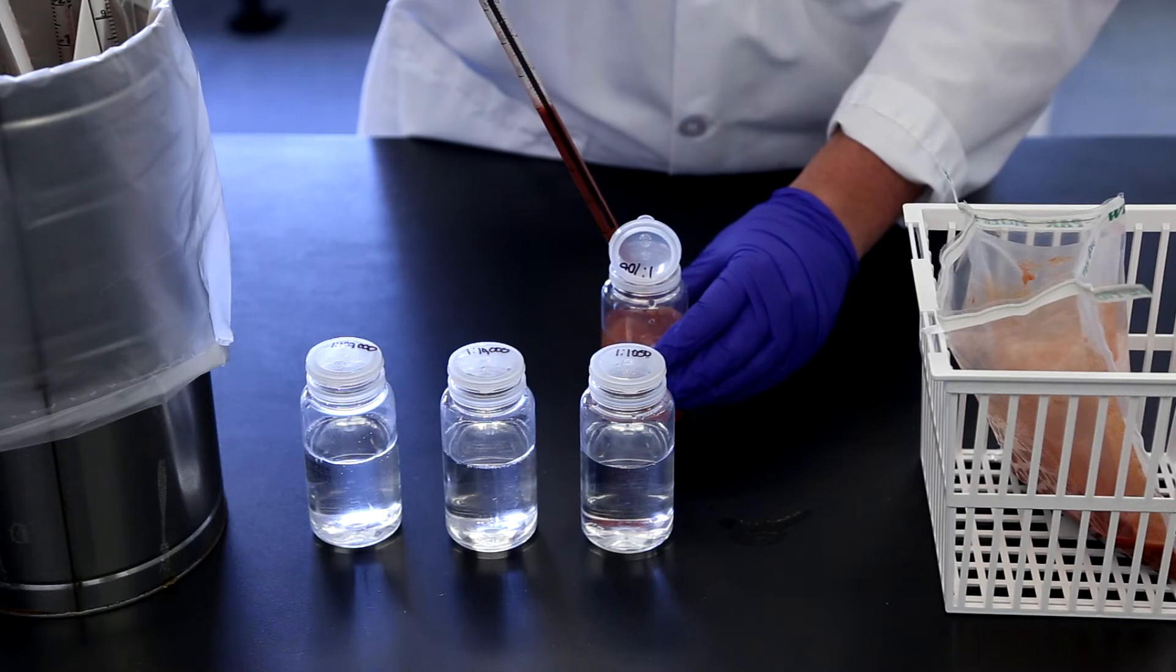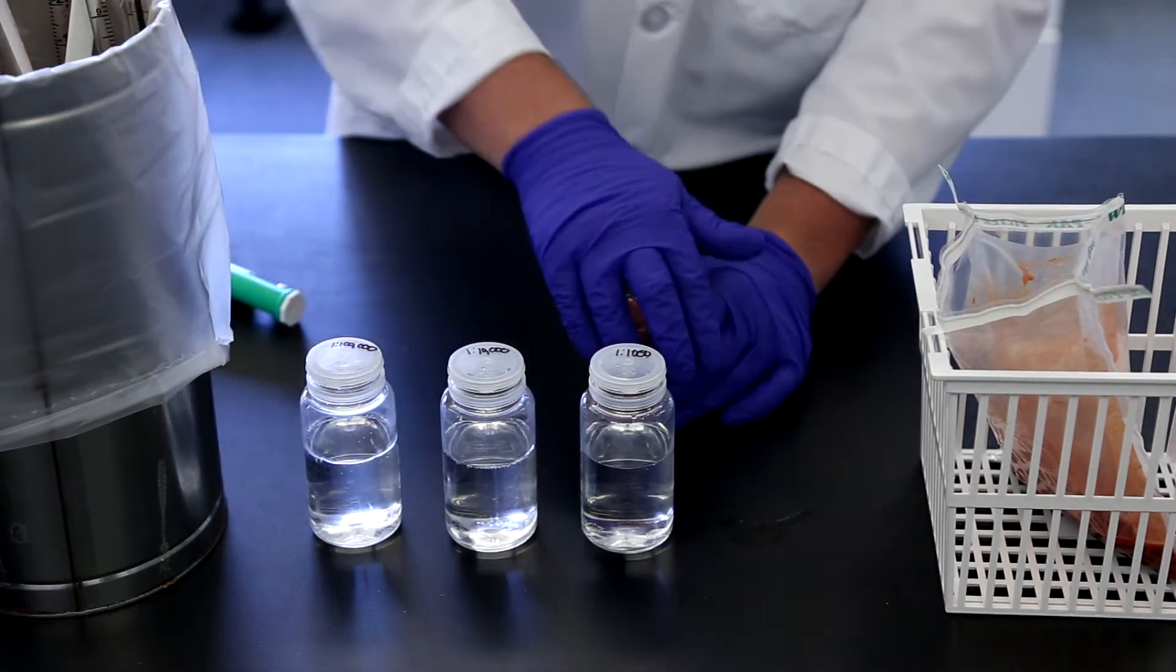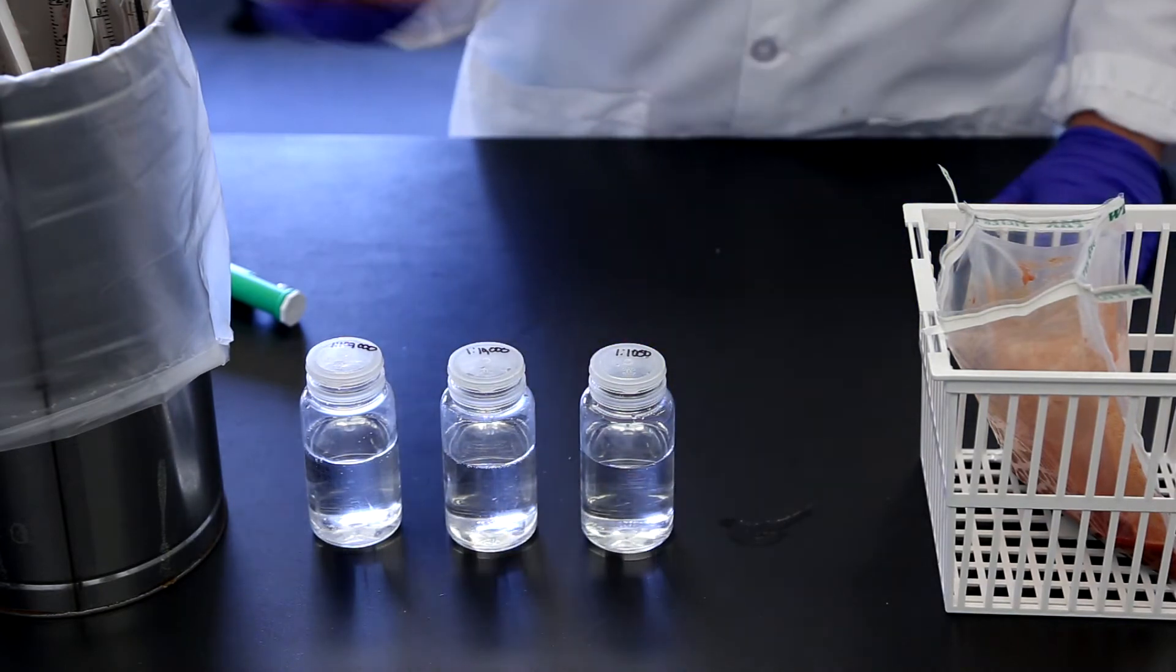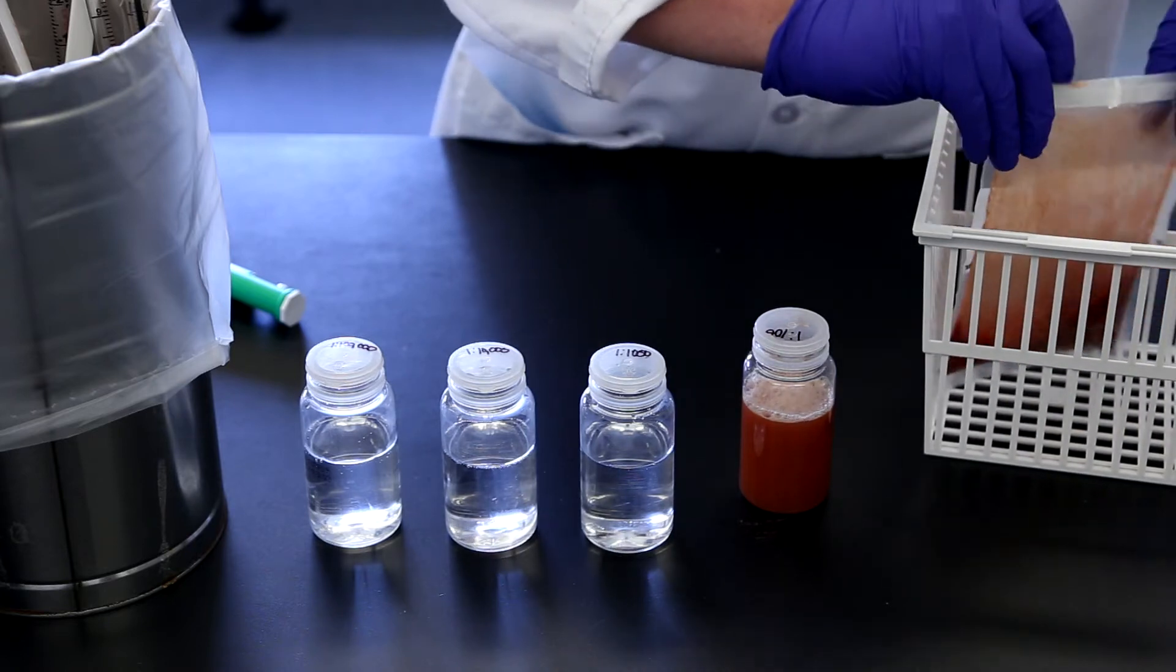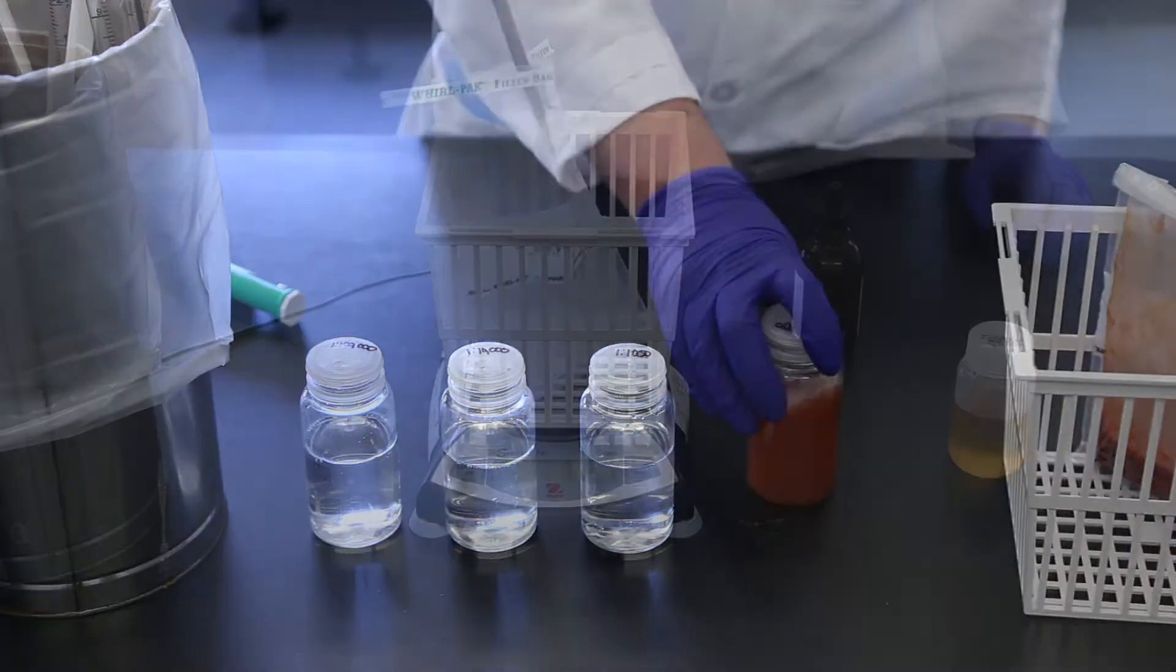Place 11 milliliters of your 1 to 10 sample into 99 milliliters of buffer. Homogenize thoroughly. You now have a 1 to 100 dilution. Repeat this process as necessary up to a dilution of 1 to 100,000 and beyond.